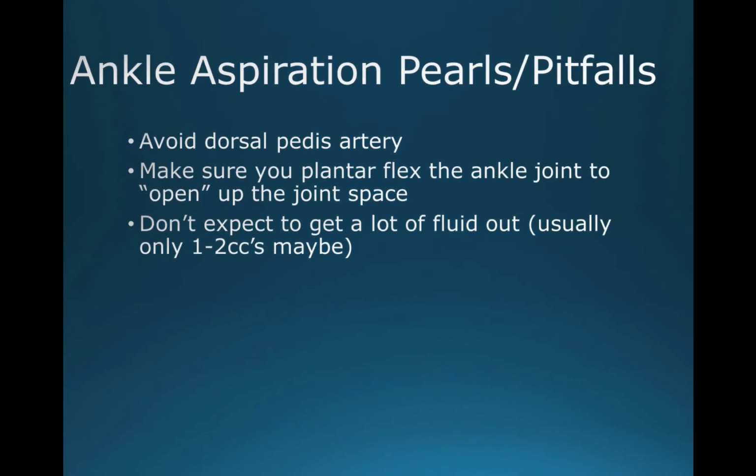Ankle aspiration pearls and pitfalls. You want to avoid your dorsalis pedis artery. It's very easy to see on ultrasound. You also want to make sure you plantar flex the ankle joint to open up that joint space. I will always say don't expect to get a lot of fluid out of the ankle joint. A lot of times in an ankle you will see a lot of fluid, but in reality it's actually only 1 to 2 cc's.